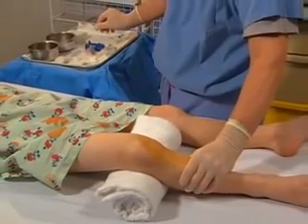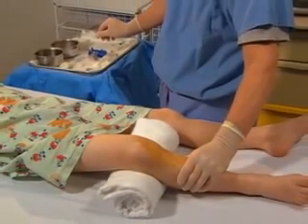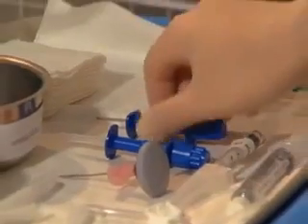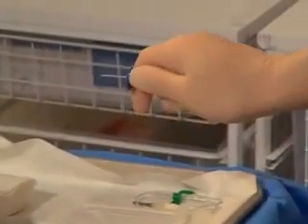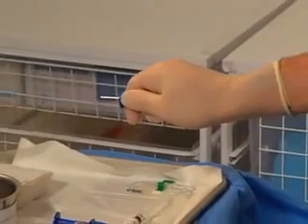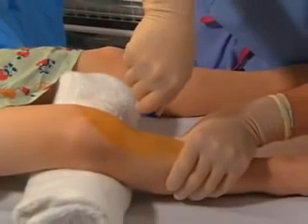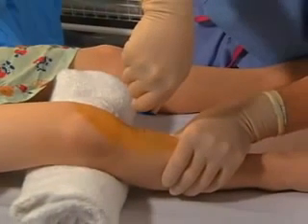Make sure that no portion of your hand is behind the insertion site to decrease the risk of needle stick injury. Place the needle handle in the palm of your dominant hand. Place your thumb and forefinger along the shaft of the needle for stabilization. Place the needle against the skin overlying the site.